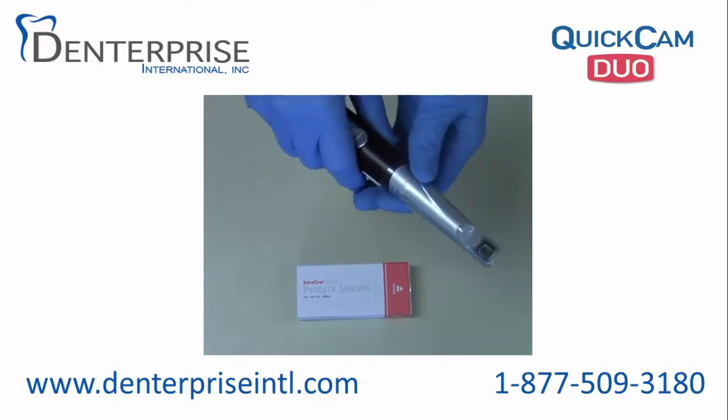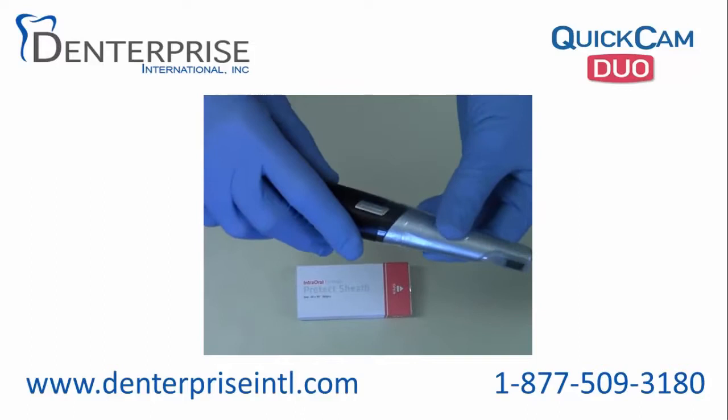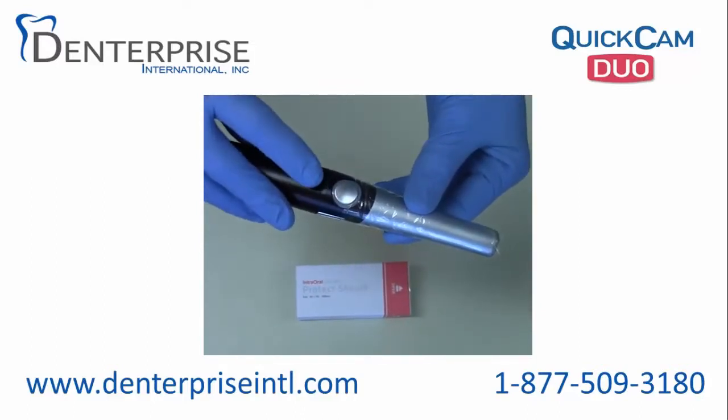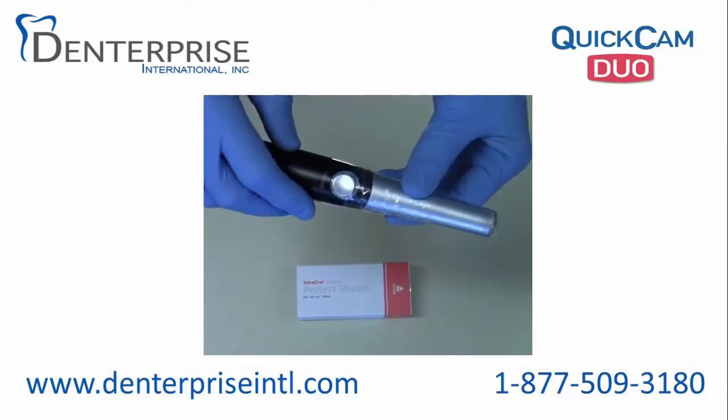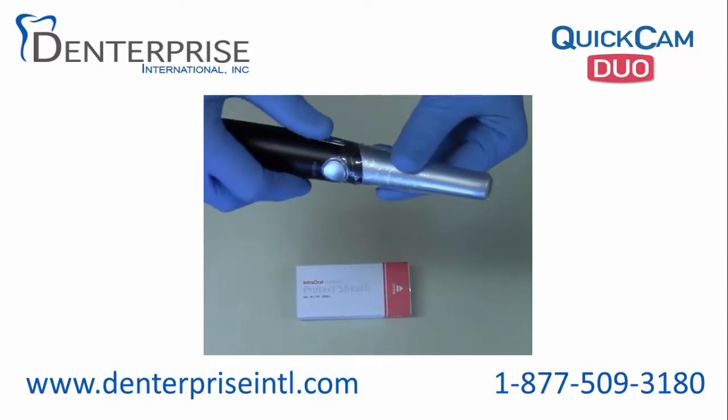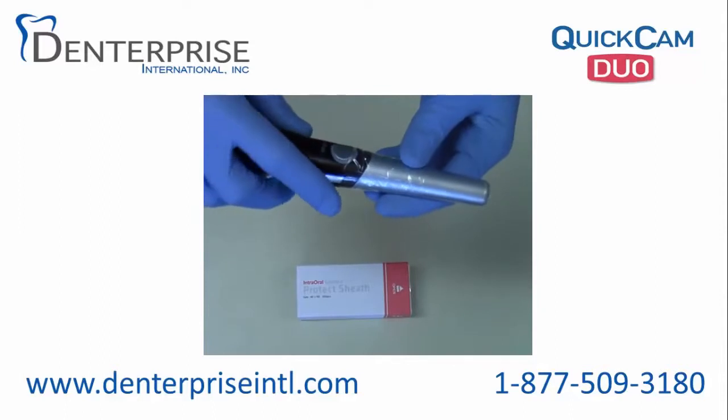Once the sheathing is in place, the major buttons are focus and then capture. There is a capture button located on each side of the camera.